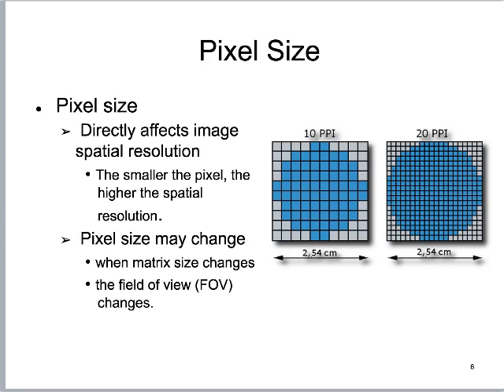For our purposes right now, I'm talking about spatial resolution. So I will definitely come back and readdress magnification and what's happening when we magnify digital images. But for the pixel size purposes, the best way that I can think about relating it, for the purposes of our images, is matrix size. Now, we cannot control the matrix size of our digital imaging systems. It's something that's hardwired into the system, that CT has a 512 by 512 matrix. Mammo has huge matrix sizes. General X-ray is somewhere between CT and mammo. This matrix size has a bearing on the pixel size.